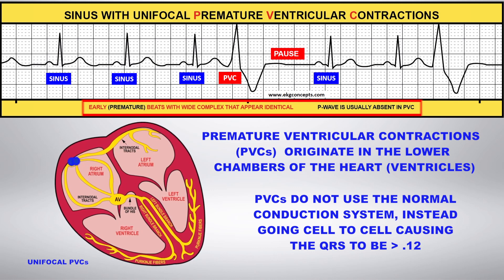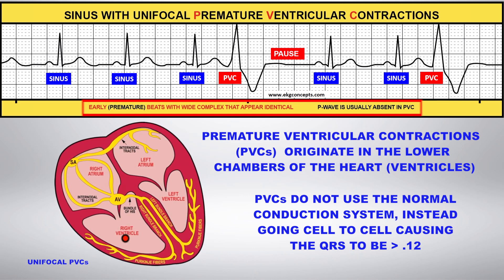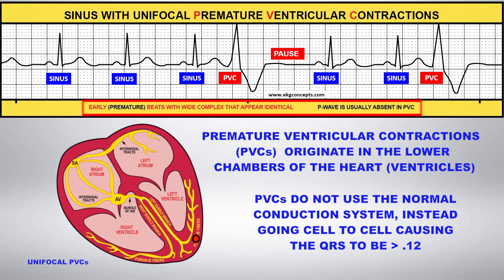PVCs do not use the normal conduction system, instead going cell to cell, causing the QRS to be greater than 0.12.